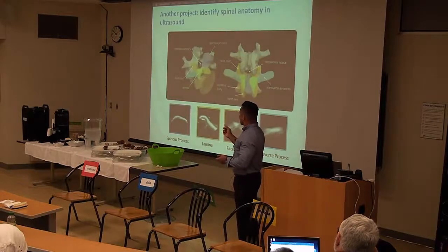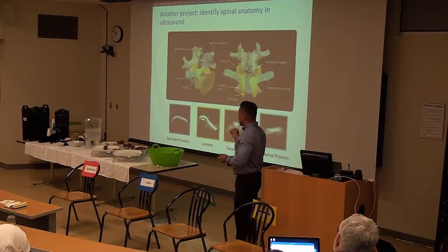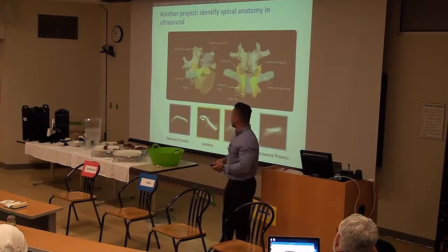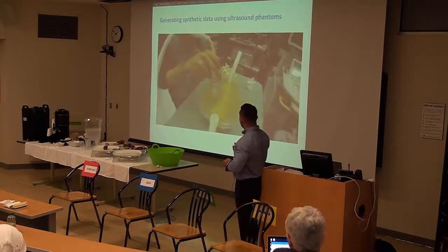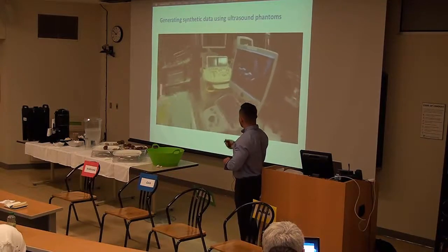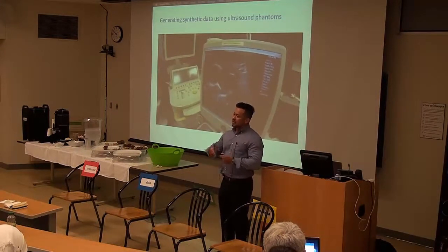This is another project that I worked on during my postdoc, and this is about recognizing anatomy in ultrasound. In this particular case, again, it was very difficult and very lengthy to try to obtain a large data set. So what we did was to create a synthetic data set. Here we have a spinal phantom, and we're acquiring lots of images, and we're training our deep learning network in recognizing features on these phantoms. When you work with phantoms, you can acquire as much data as you want. There is no limit to the amount of data that you can create.